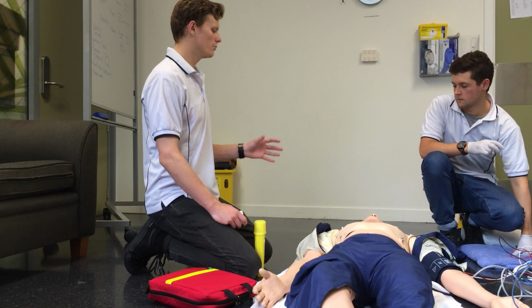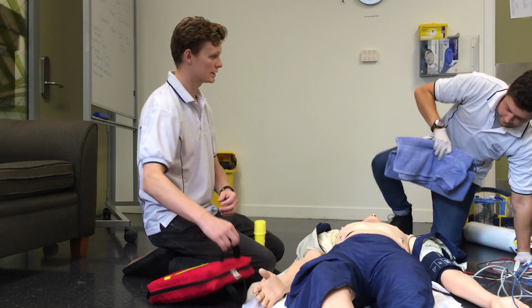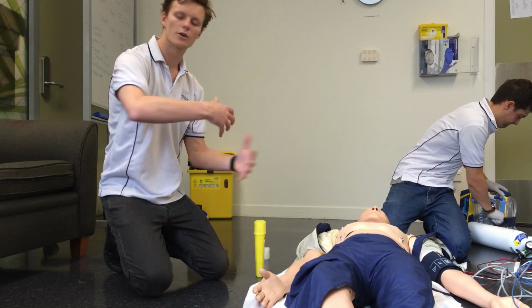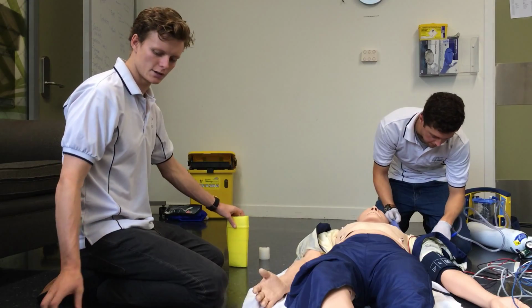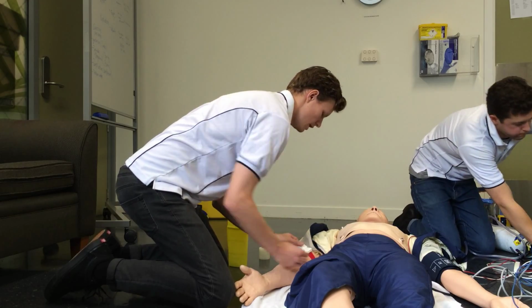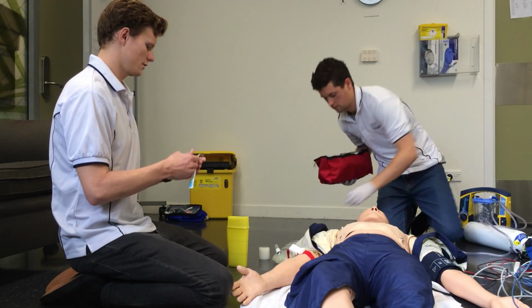So Jacob, if you want to position the airway and put a towel on his head, ET tube and suction. Do you understand that? Are you comfortable? Towel, ET and suction. Because my patient appears to be a little bit combative, moaning and groaning and tensioning, I'm going to be looking at giving some morphine under the combative patient scheme. So I'm looking at his arms. I'm also going to get preferably 2 IVs for fluid management as well.